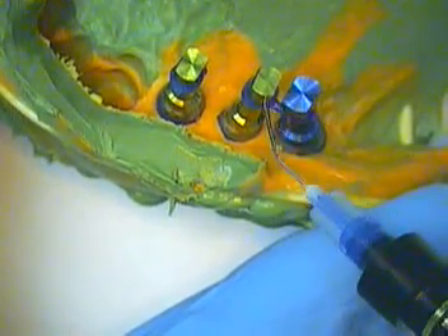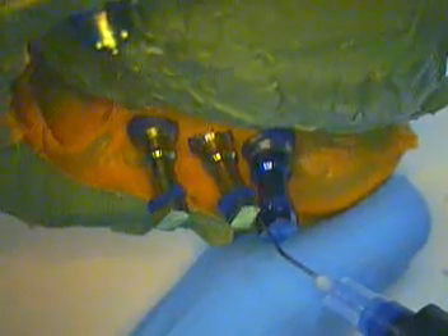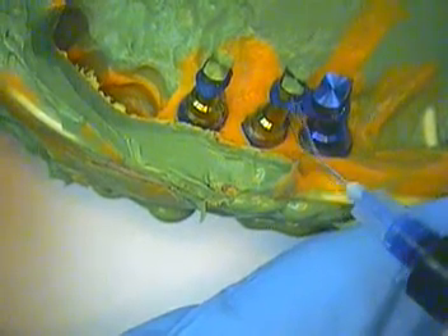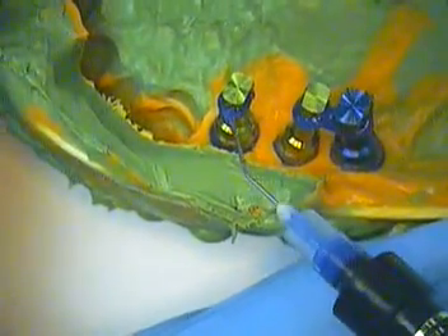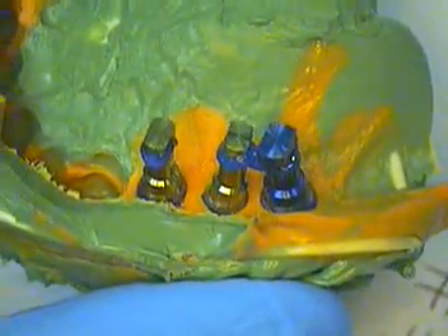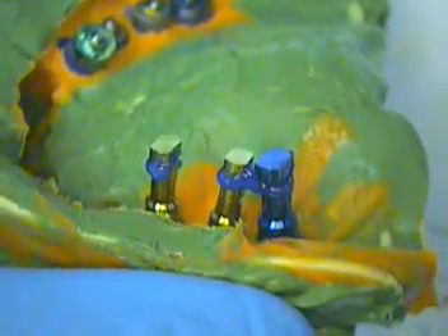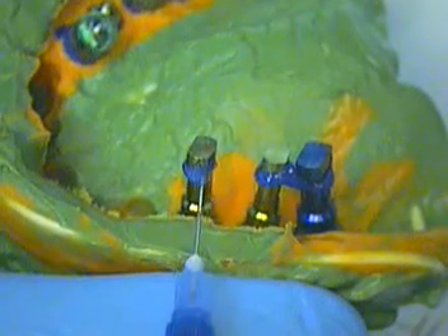We'll do that here, and we'll do it to here. It's very versatile and easy to use, and I'd like to teach surgeons how to use this technique in the mouth. It's real simple — a little hard to video record as I'm doing it in the mouth, but it's very fast, not even 10 minutes. You can have it in there and cured. So now I'm just going to place my bar, and that'll stick right in with that. I might just put a little bit more material right here.